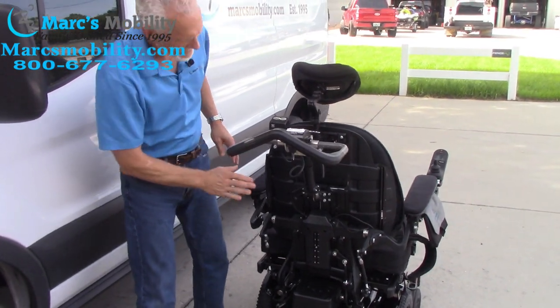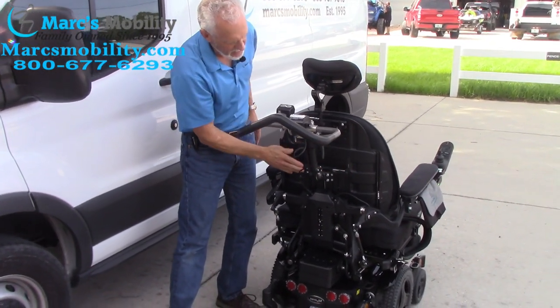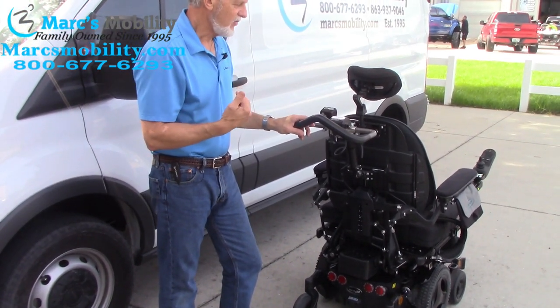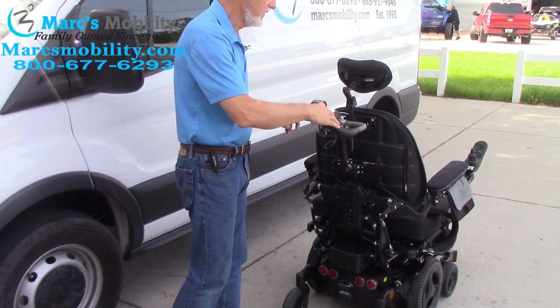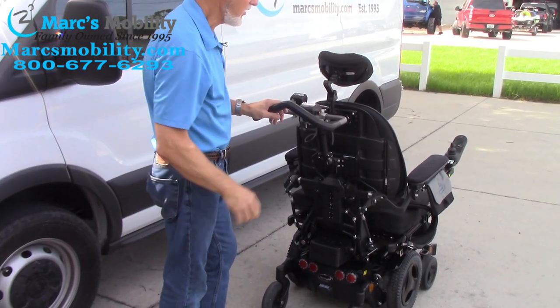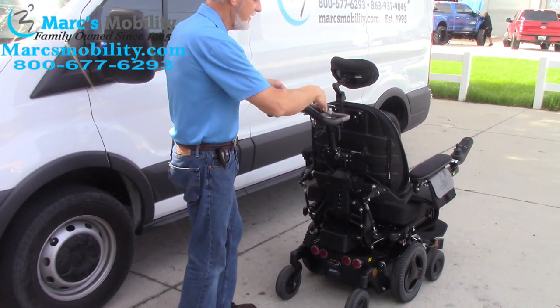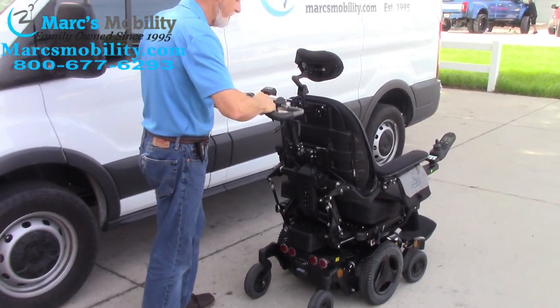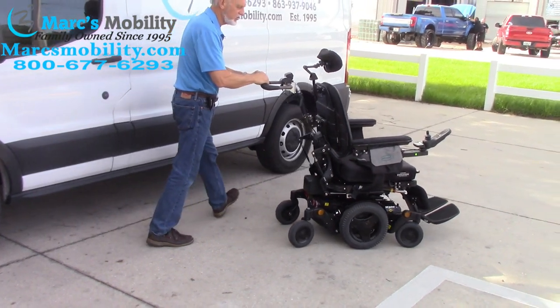This will fit any of these power chairs with this type of back. Now the nice thing about this is I can drive this chair with these handlebars. When you're driving it, the front joystick is not going to work. So all I have to do is squeeze inside the handlebars right here — there are little levers and if I squeeze them in I can start going forward with the chair.